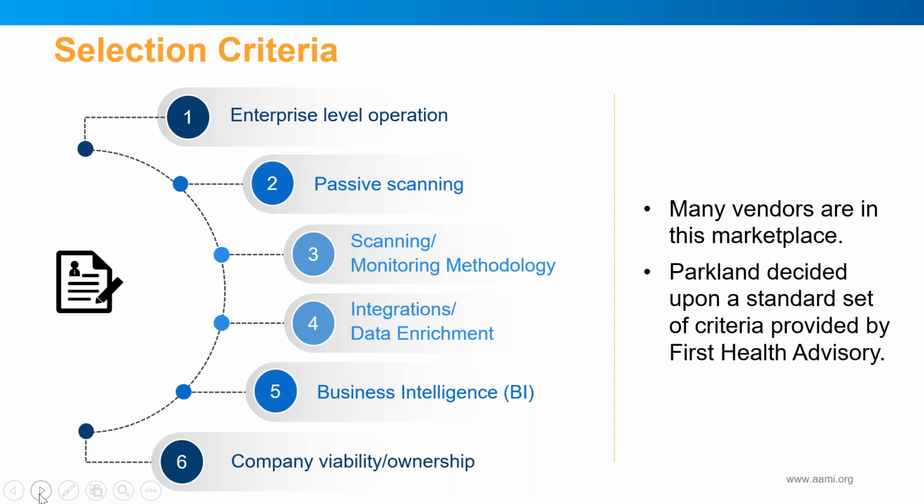But whatever way or variation they're doing it, they're scanning that traffic, identifying devices, what those devices do, medical devices, make, model, the actual serial numbers in some cases, and on and on. So they profile those devices and what their normal behavior should be. So passive scanning is one of the best requirements.